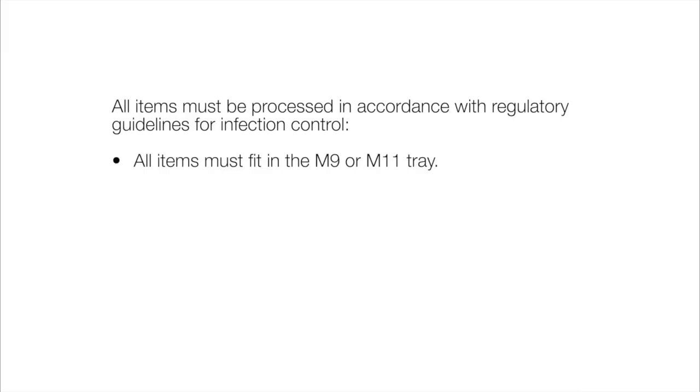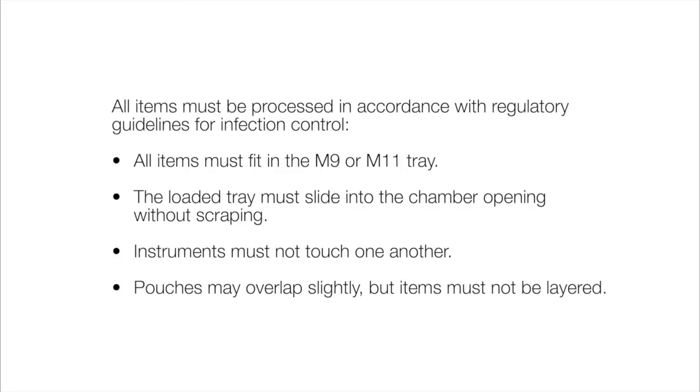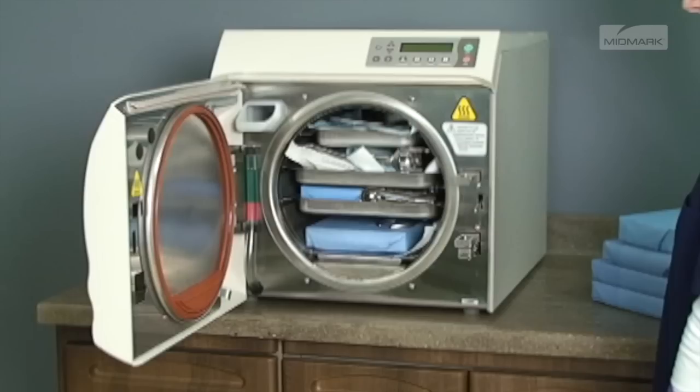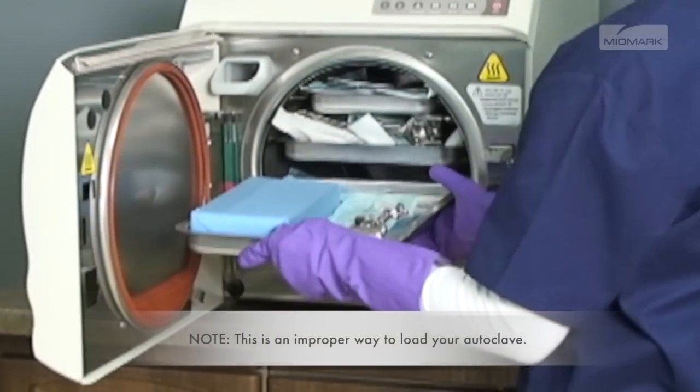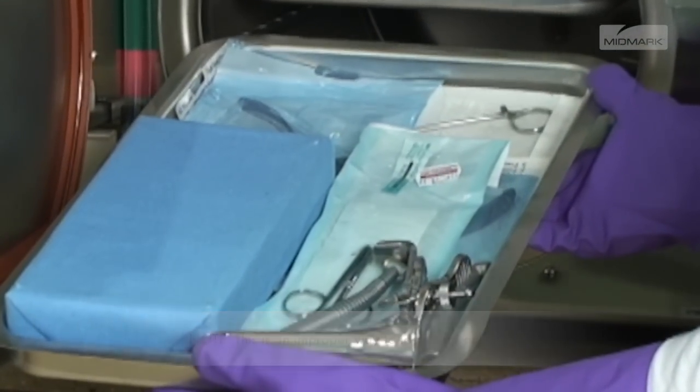All items must fit in the M9 or M11 tray. The loaded tray must slide into the chamber opening without scraping. Instruments must not touch one another. Pouches may overlap slightly, but items must not be layered. Refer to the charts in your installation and operations manual for maximum sterilization loads. If a load surpasses these limits, divide the load and run multiple cycles. Do not overload the chamber, as adequate space is required around items and trays for steam circulation and drying.